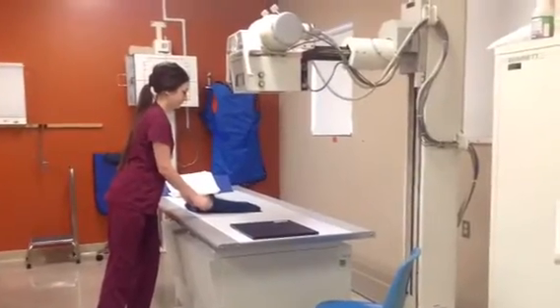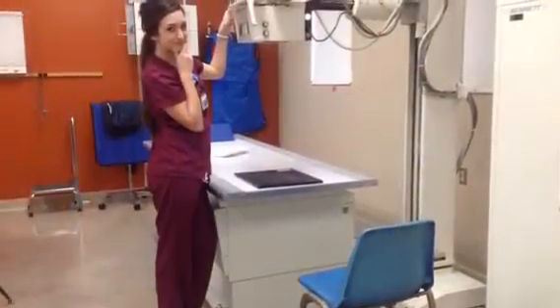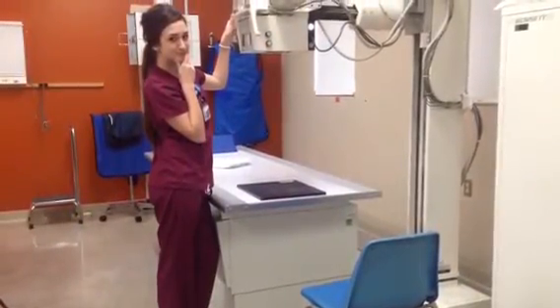A radiographic exam performed on a patient with a cast should begin just as any other exam, starting with the setup of the room before the entrance of the patient. Once your patient is in the room and made to feel safe and comfortable, a medical history should be taken.